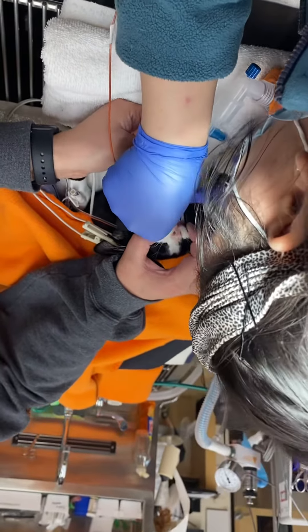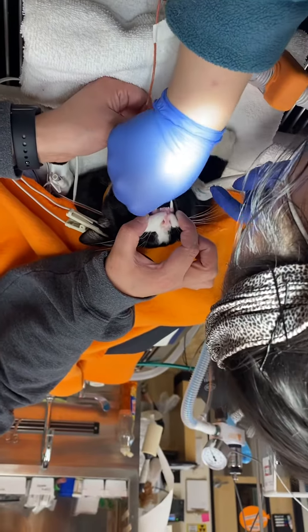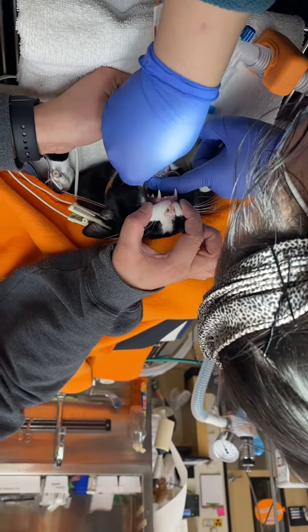This is just a tiny little tube. I'm going to take that through. It is going — it's just a very tiny tube.